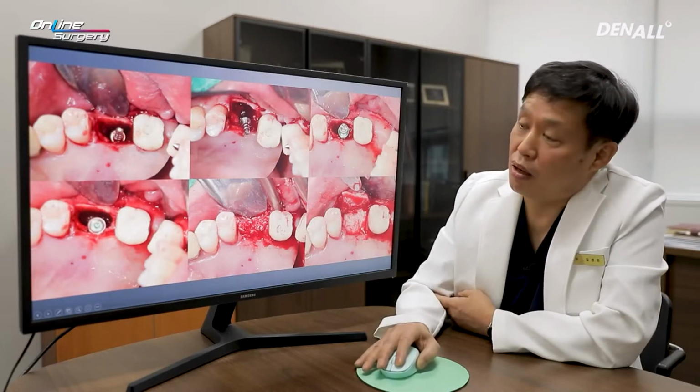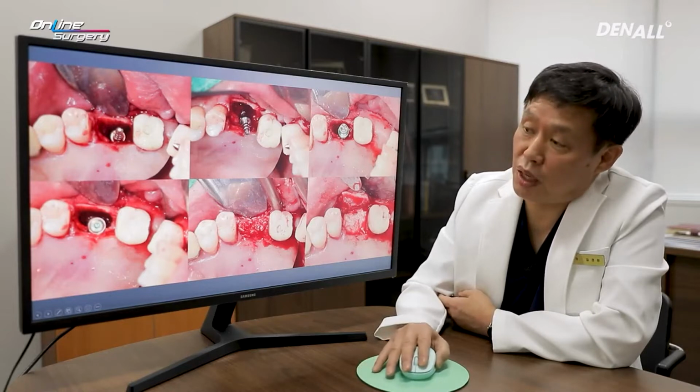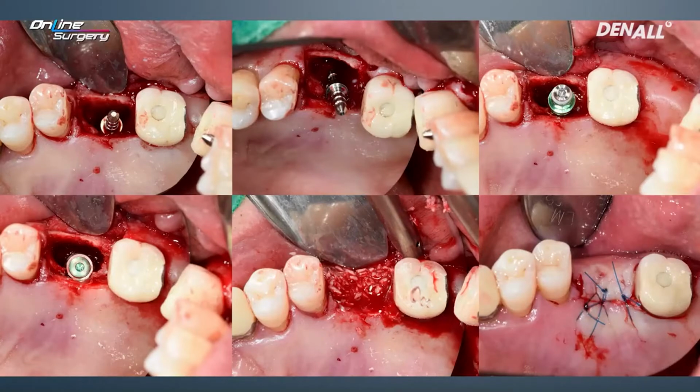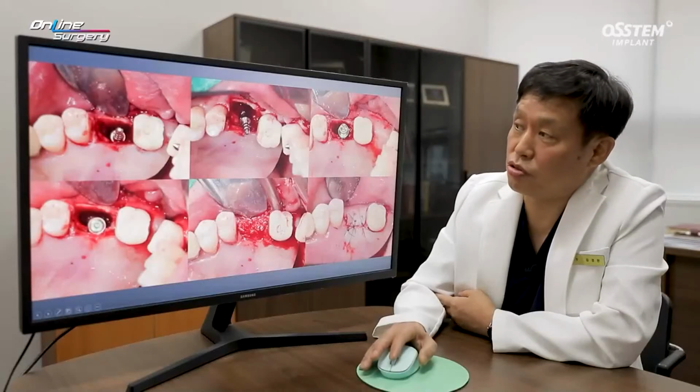Pre-mount and cover screw was connected. You can see that because we did not damage the buccal plate as we removed the implant, I decided to use Sure-Os and allograft. Covered with collagen membrane and completed the case after suture.